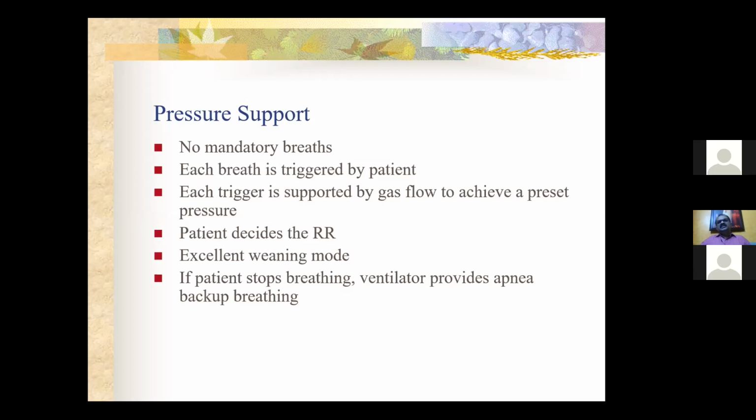If the patient is not taking any breath within that 20-second period, the machine will go into an ACMV mode. That is what we call a backup breathing, apnea backup. Usual time that the machine is going to wait is 20 seconds. That is usually preset in that ventilator. When you are setting up a ventilator, we'll see that later. You should be setting up the apnea backup also in a pressure support mode.